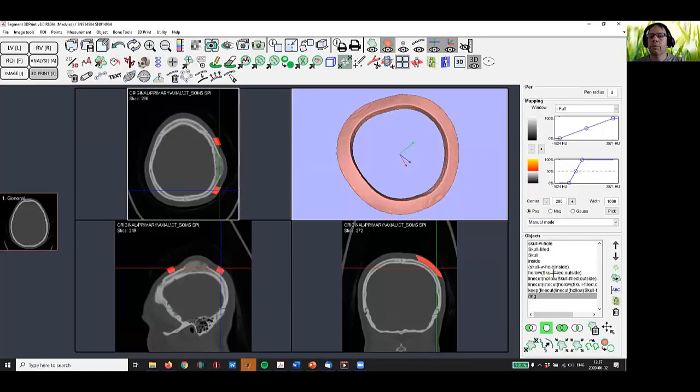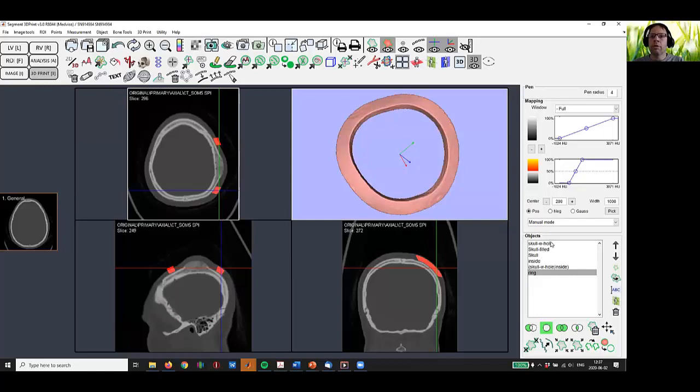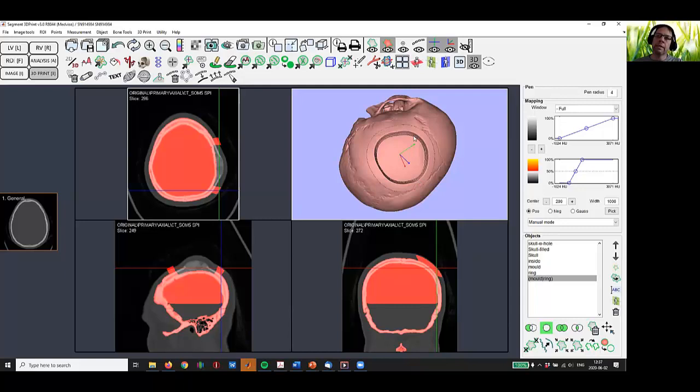We take away some of the parts we don't need, and we can try on, yes, this is the mold, so we should rename it to that. And we can try the ring on the mold, and we can see, yes, it fits perfectly to the mold. And here we can see the surgeon should draw inside, and it's much easier to hold the ring and draw inside and then hold the ring and draw outside where you want to make the cut.